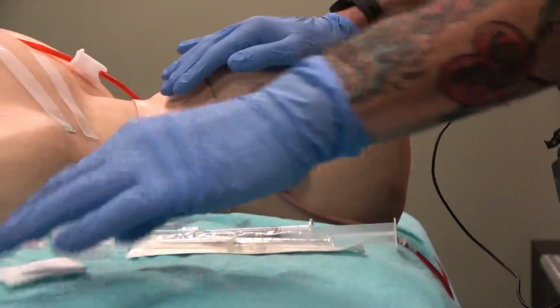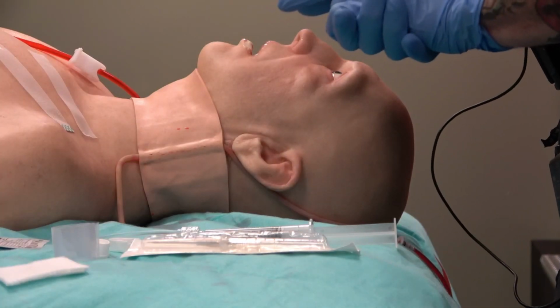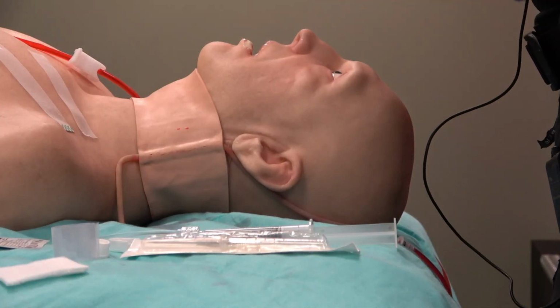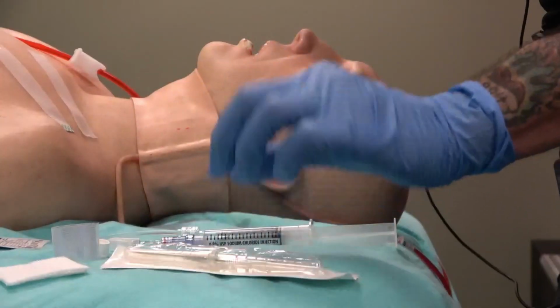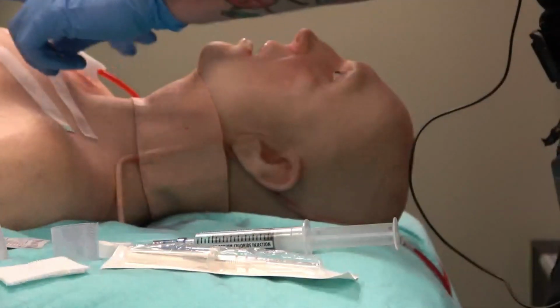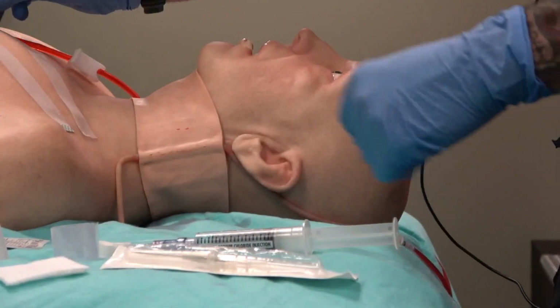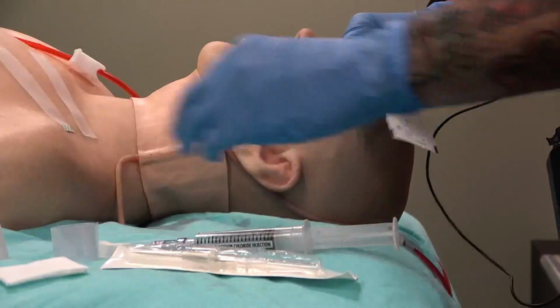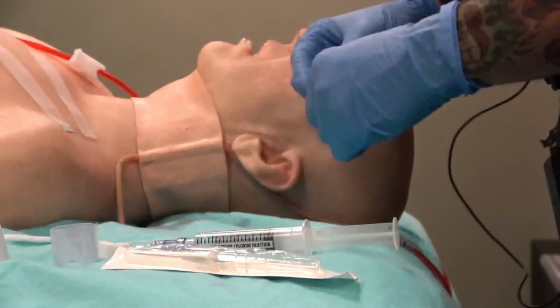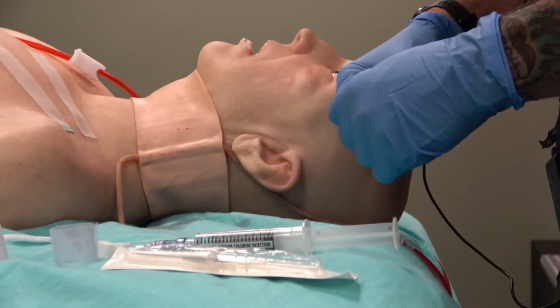All right. So let's go ahead and make sure I have my supplies correct. I have a 16 gauge, I got a flush with a lock, I got 2 pieces of tape here, I have a Tegaderm and something to clean my site, as well as some gauze here. So I've identified my EJ site.